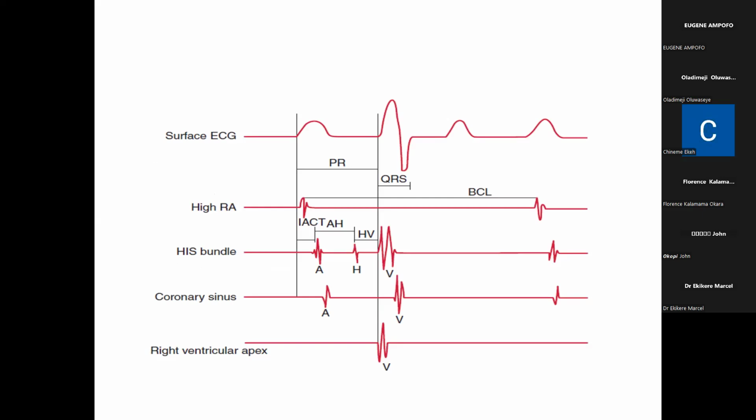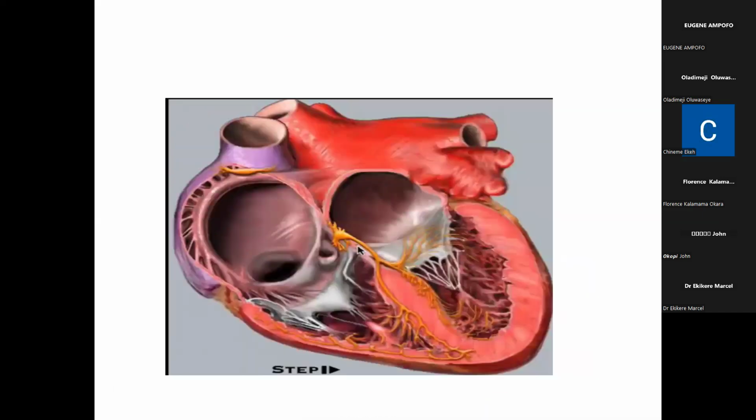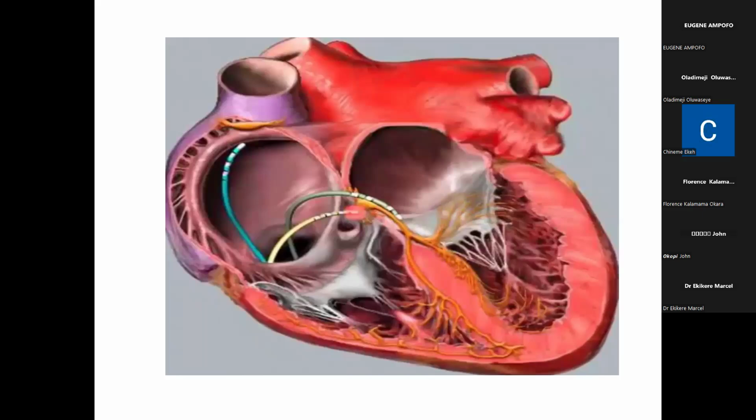So remember we said there are different catheters. So I'll go back to these catheters again in the atrium. So we can see these catheters again in the atrium. You see the catheter in the right atrium, close to the SA node. You see a catheter in the His, touching the AV node, the His catheter.